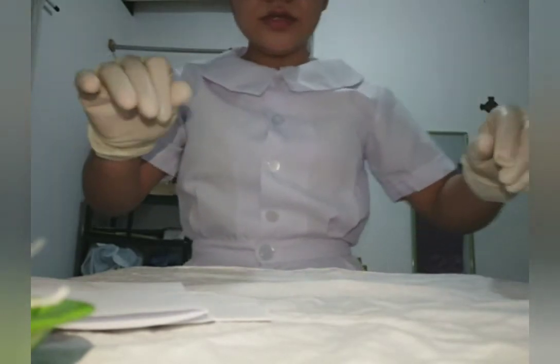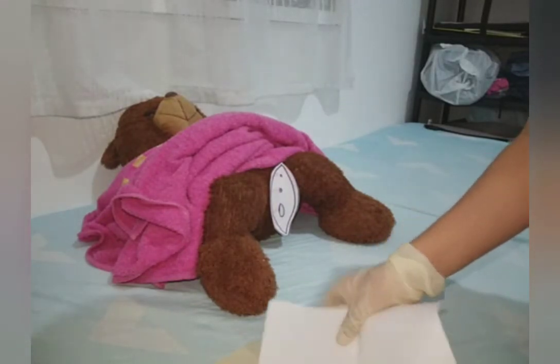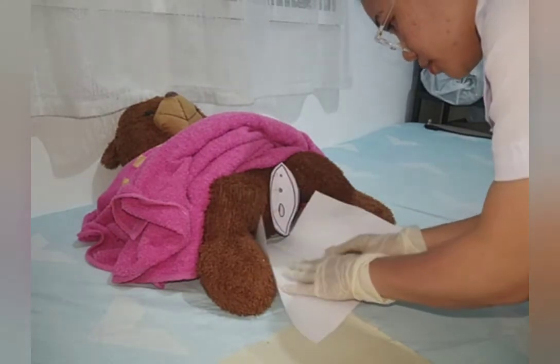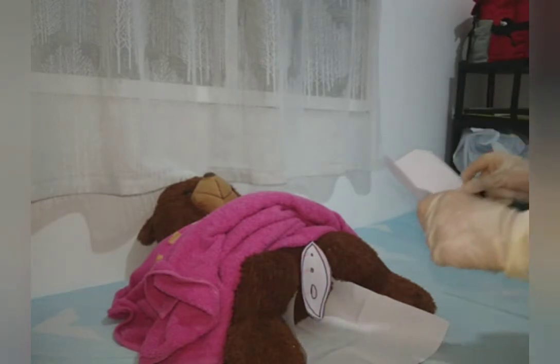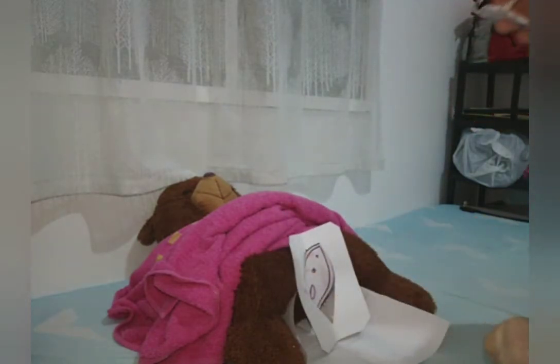Now I will start draping my patient. Here I have my underpad and fenestrated drape. First I will put on the underpad, maintaining the sterile field. Ma'am, would you lift your hip a little so that I can put the drape under the buttocks? Now I will put the fenestrated drape over the perineum with the hole over the labia. I will only expose the area required for the procedure to provide more privacy to the patient.